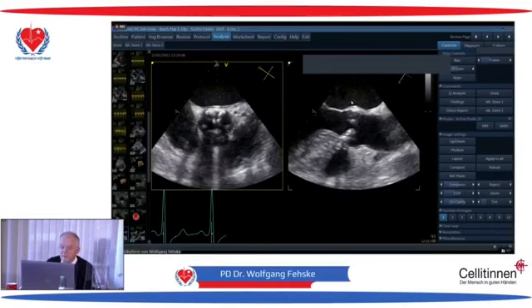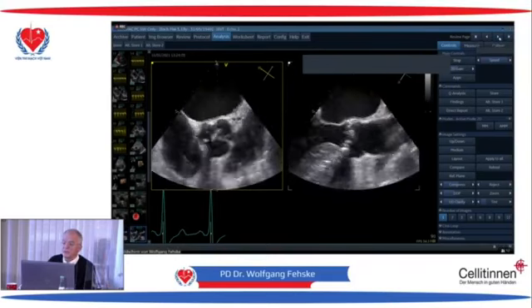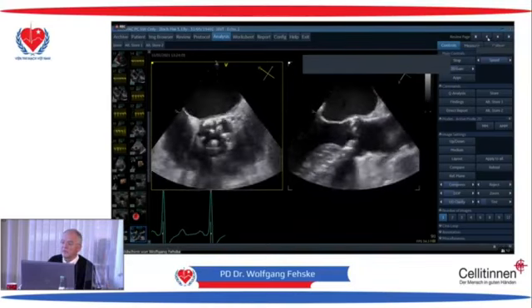In this position, you have no optimal result because there is shadowing of the calcium here. If you're in this angulation, this is the middle of the probe, and in that angulation, you always will have shadowing here. Look what I've done then. I have changed the position of the transducer probe. You see the difference?